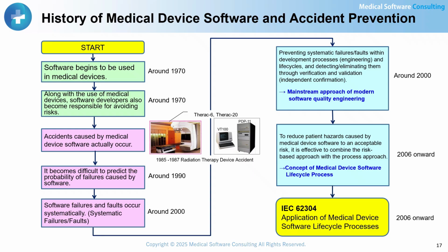Then, in 1985, a serious accident occurred with the radiation therapy device Therac 25. Due to software defects, 6 patients were injured or killed. This tragedy triggered discussions on establishing regulatory requirements for medical device software.